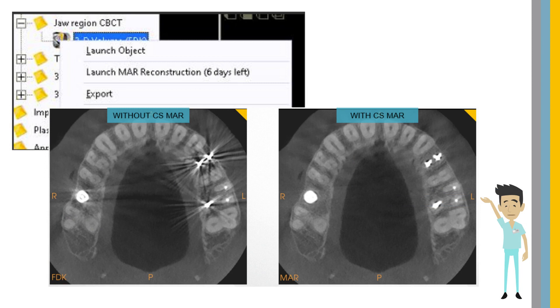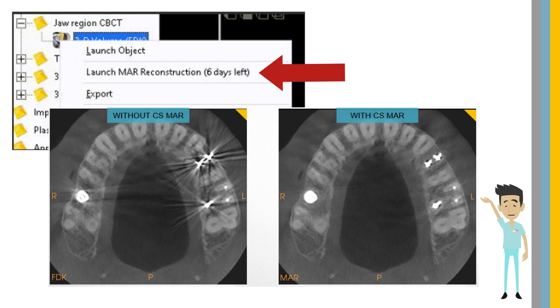The MAR, Metal Artifact Reduction function, is now available for 3D images acquired with the CS8100 3D. This feature must be activated within 7 days of the image acquisition date.